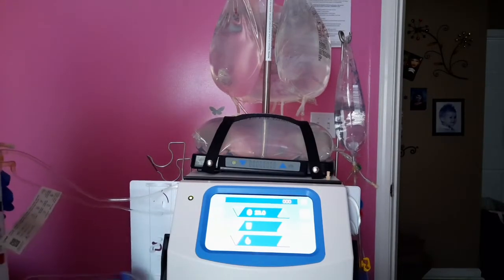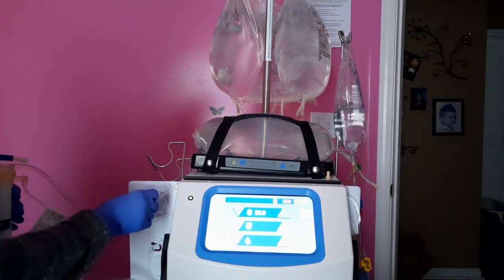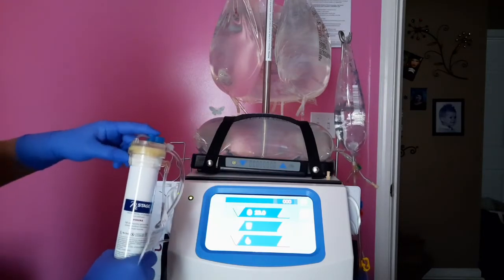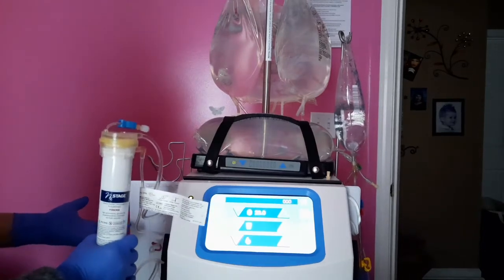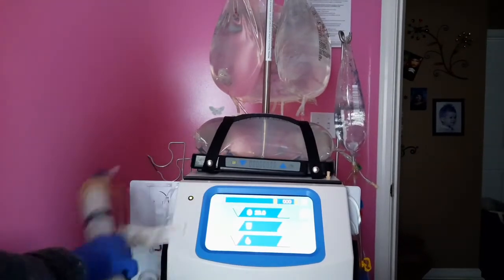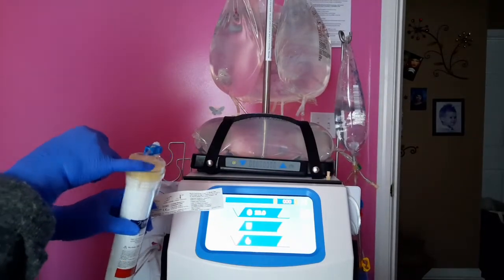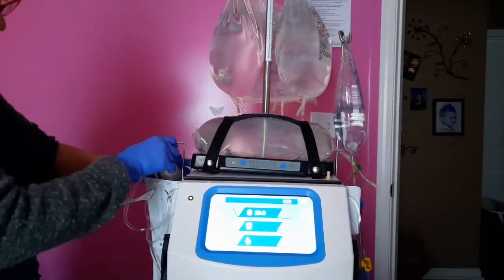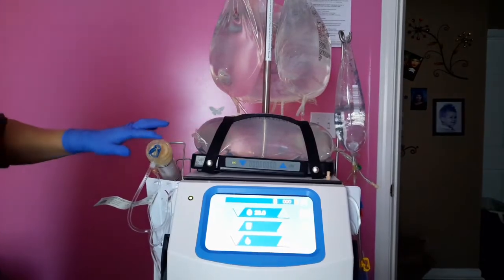Okay, and with your lines as straight as can be, what you do is, holding the bottom of the dialyzer with the blue clamp on top, you're going to one, two, three, tap, straighten up, tap, straighten up, tap, and straighten up. And what you're looking for is this air right here. You want to look at the top for some air. All right, so we've done that. So with the blue clamp on top, we're going to slide it into some carrier right there, making sure the clamp is on the top.